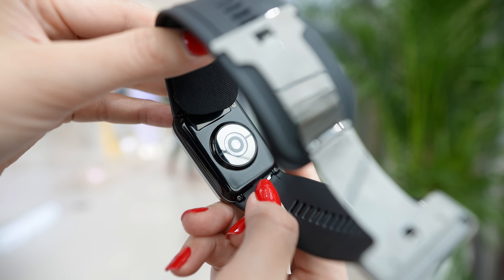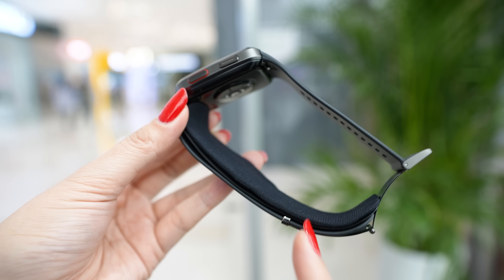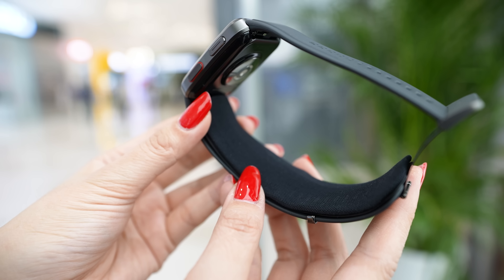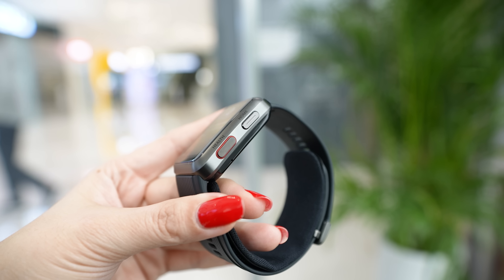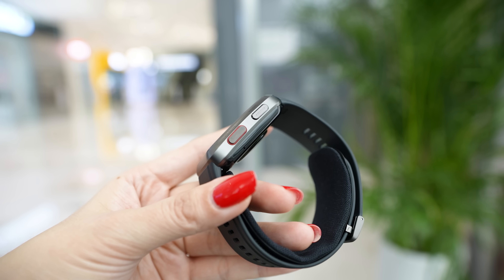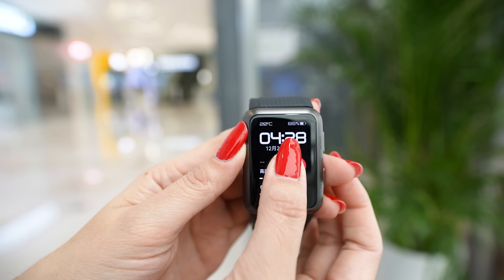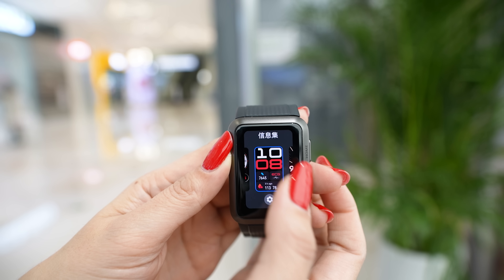The strap is very easy to change. Here you can see the coupled air inlet — this is where air enters to measure arterial pressure. On the left side there are two buttons: a home button and a button to access health functions. On the main page you can see the time and other information, and you can change the watch face here or choose more options in the app.